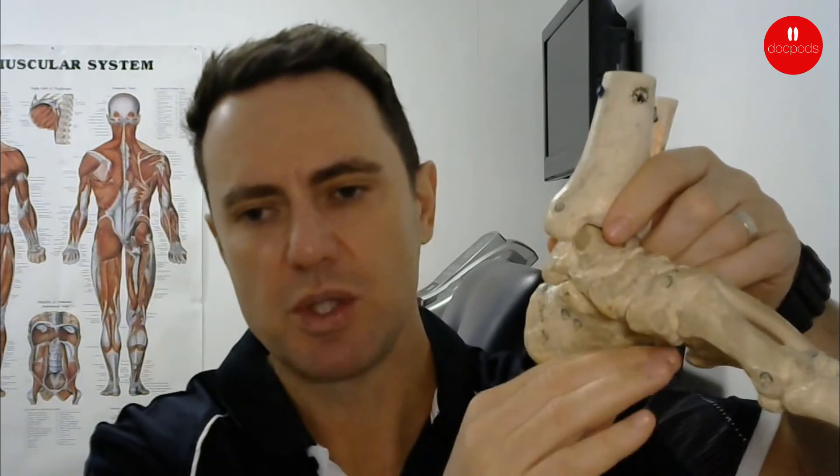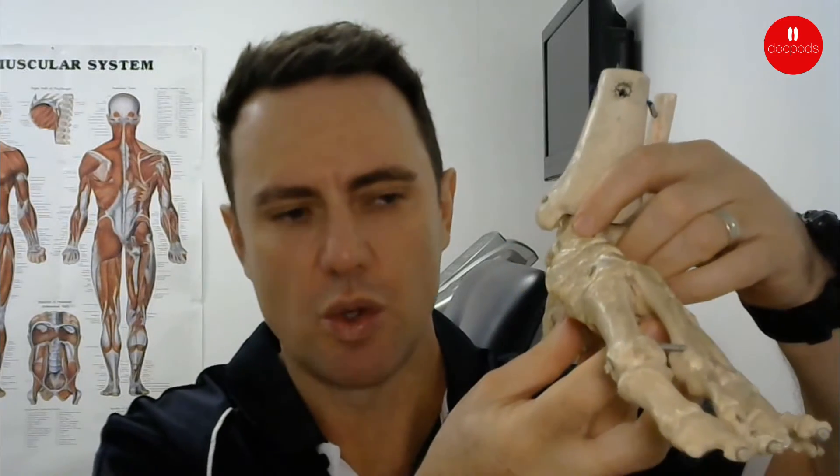What an orthotic does is help to keep the foot in a more neutral or normal position and make it a more effective lever for propulsion.